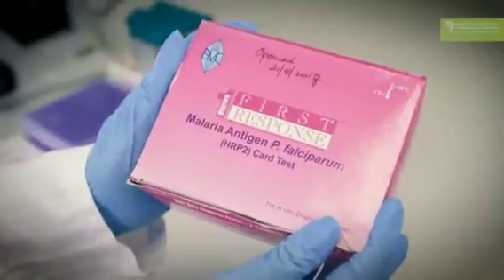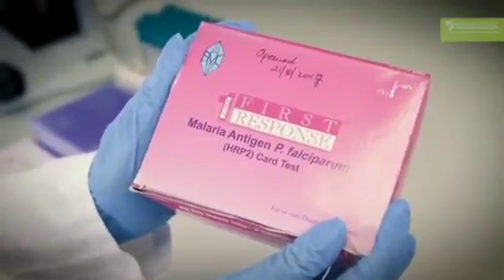Rapid diagnostic tests are very simple to use, but you need to follow very simple rules to make sure you get the correct result. In South Africa, we use the First Response rapid diagnostic test, which tests specifically for falciparum malaria, which is the most common malaria found in South Africa.